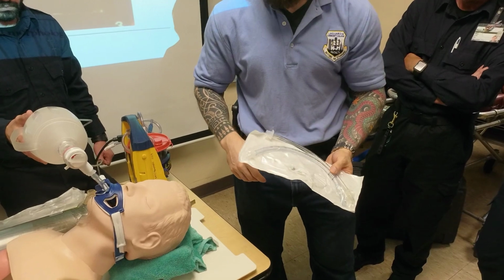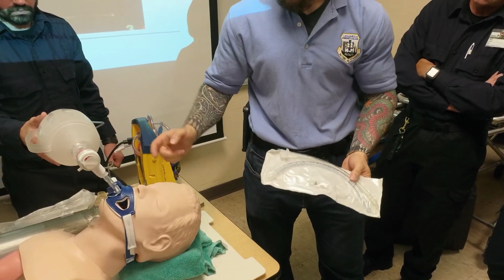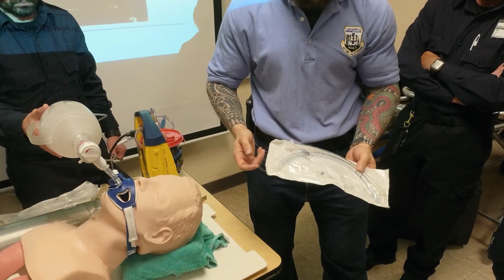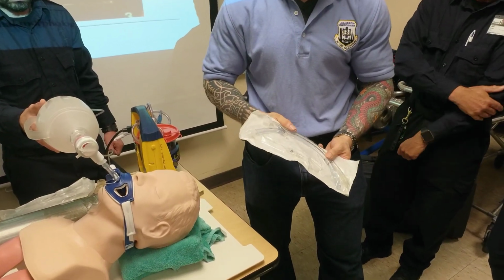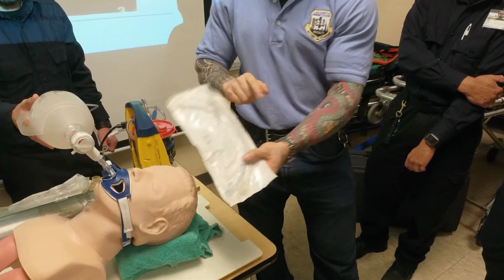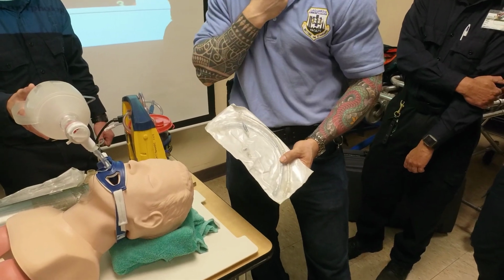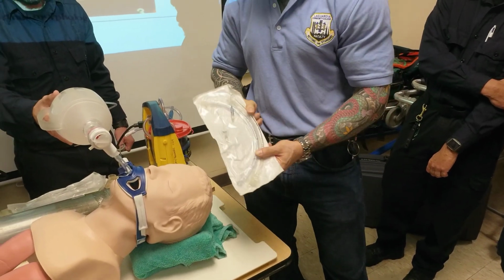They tell you that, but it's usually, from my experience, it's never worked out. So have a couple of them ready, but for an adult male, I'll put probably 7.5 and 8.0. Any other questions? So there is no measuring mechanism for this? Yeah, once you open up, you got to look at what you see. If they have some spasm and you see just a little bit, I may try a smaller size.